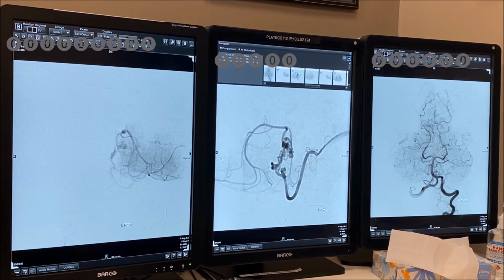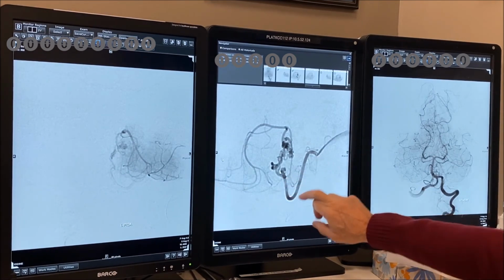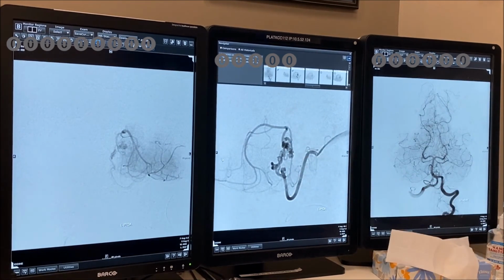Control. So glue, obviously, the dilutional component of the glue will determine how quickly it sets. You can't have a glue that you inject that will set too quickly. Glue could work, but it's a hit or miss. I can't reflux. I know that if I reflux, this segment has a lot of very important, non-forgiving arteries. You could do Onyx with a Scepter or something. Yes. You can also do surgery. You can clip here and clip there. It's possible, but you have to open the head.